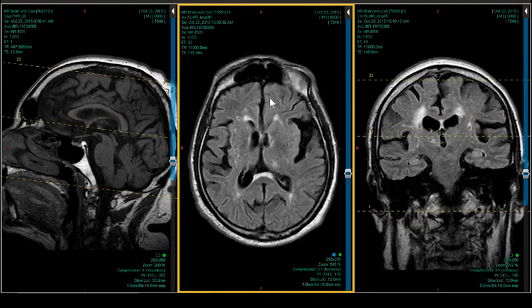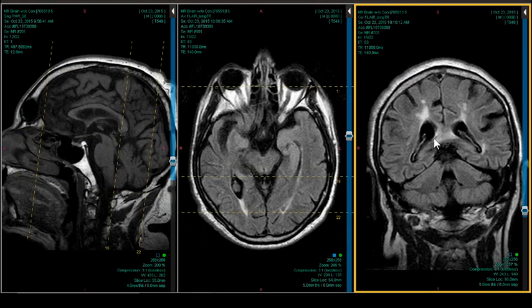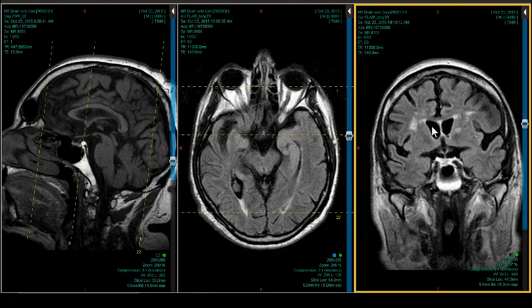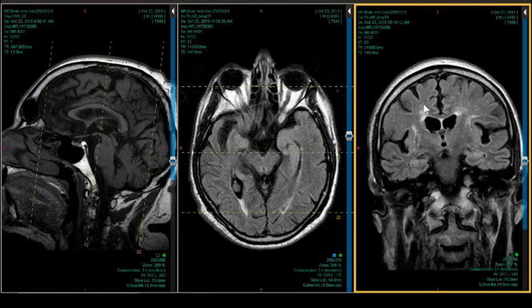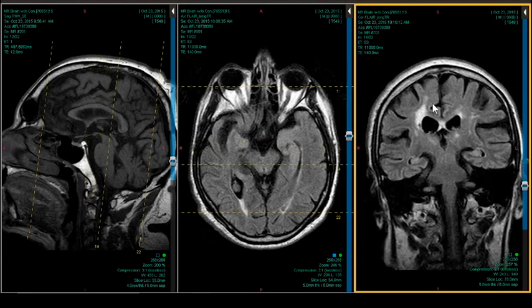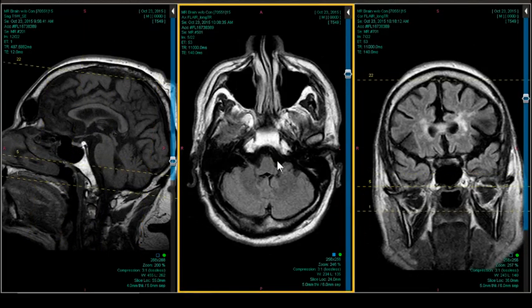Because you could report this out and say, wow, cerebrovascular disease, a couple of infarcts, I guess that's the problem. So in terms of discussing this pattern of vascular gliosis, so to speak, we've got mostly periventricular gliosis, but we've also got some patchy, but not subcortical gliosis. Some of it's confluent. And the way I usually deal with this is I describe it.